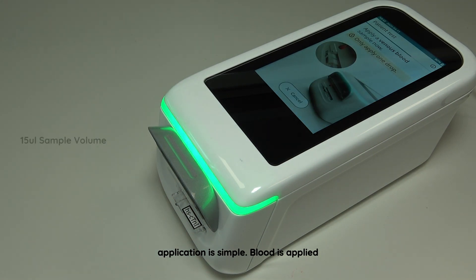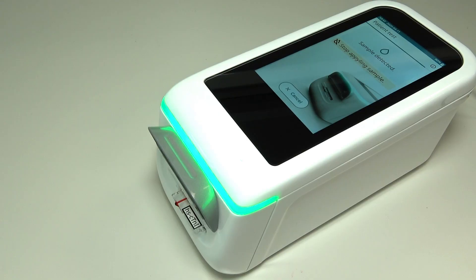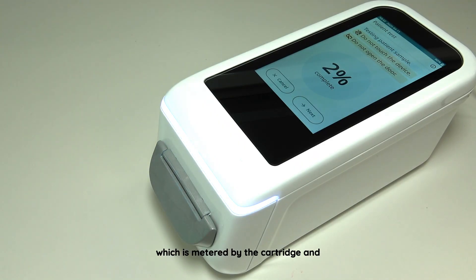Sample application is simple. Blood is applied directly to the cartridge from a vacutainer using a transfer device. No sample prep is required and there is no red cell separation in the cartridge. Only a small drop of blood is needed, which is metered by the cartridge and detected by the instrument.